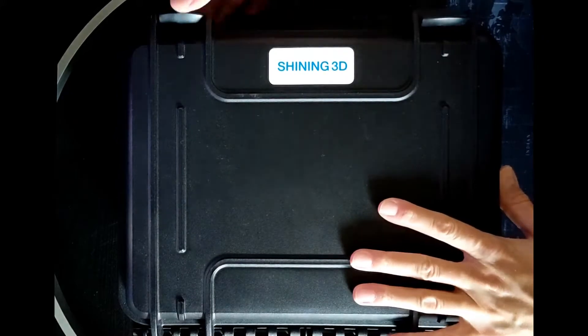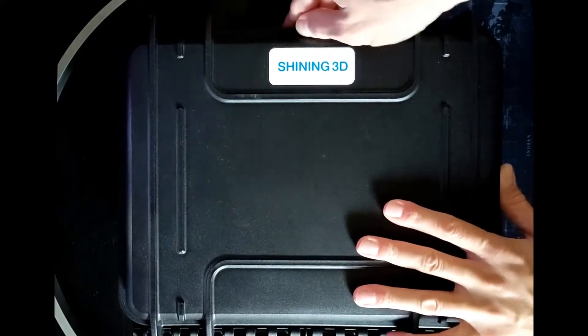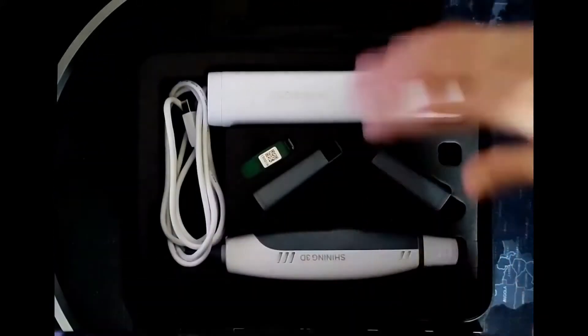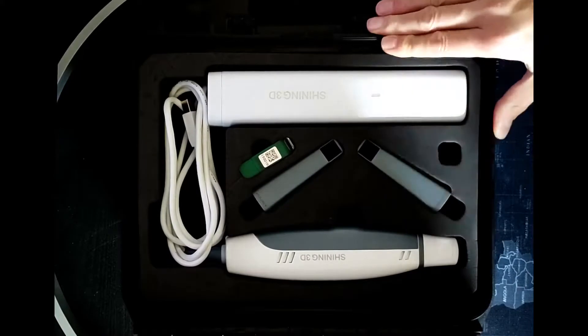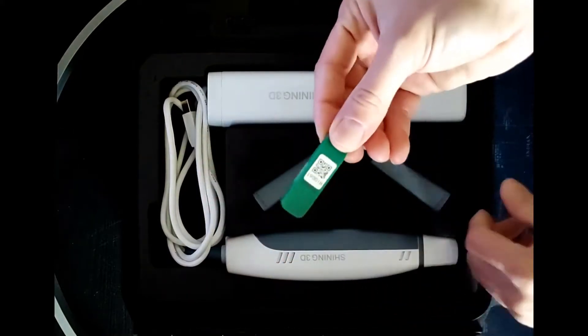Opening the box we can see the device, the calibration tool, the dongle and the two scanner tips.